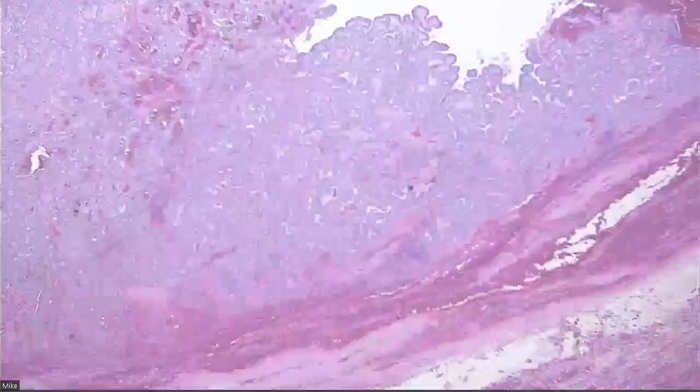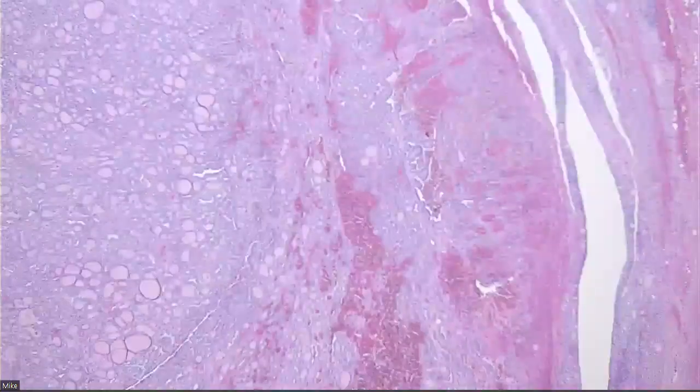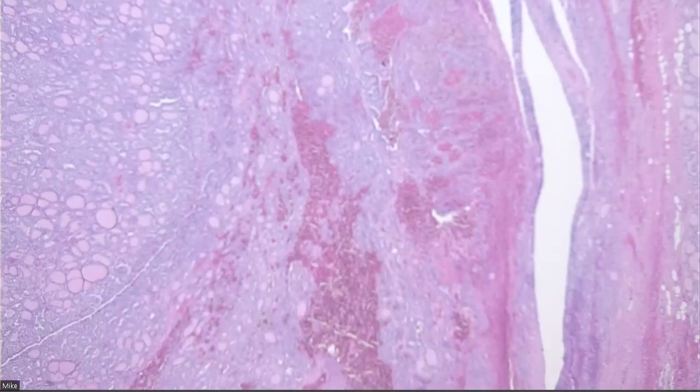So then this one. Circumscribed follicles. I don't like this corner. This corner is starting to actually get some papillary structures and hemorrhage. And what do we do? Are they true papillae?